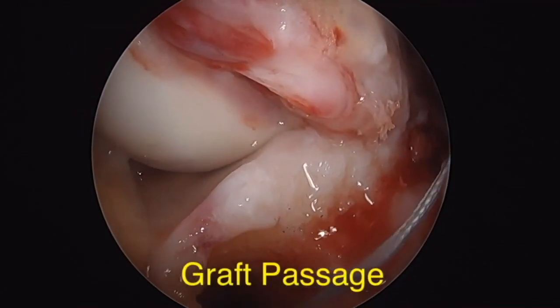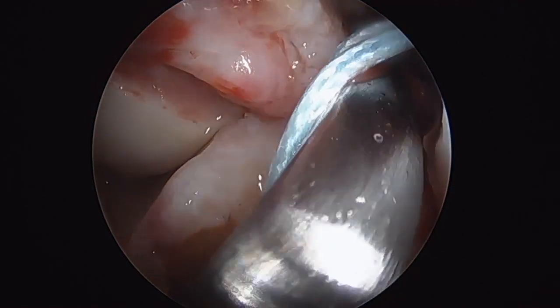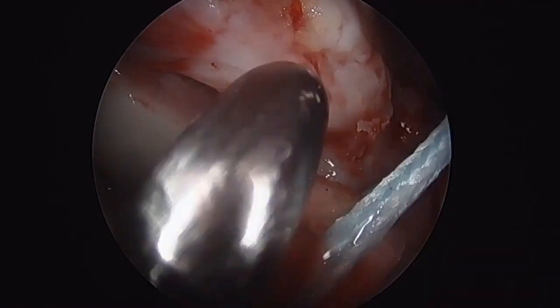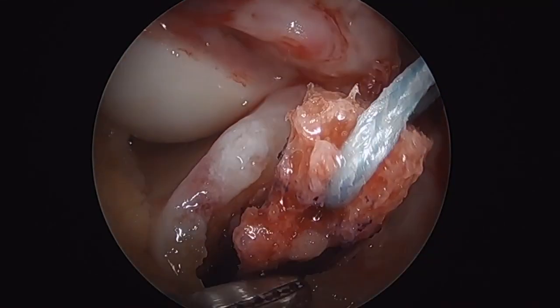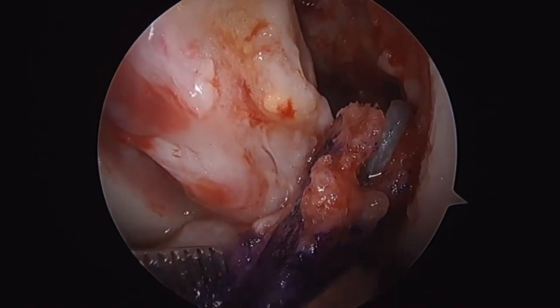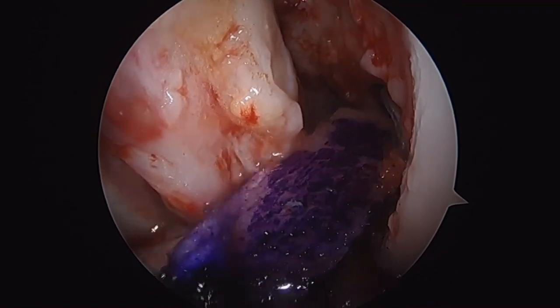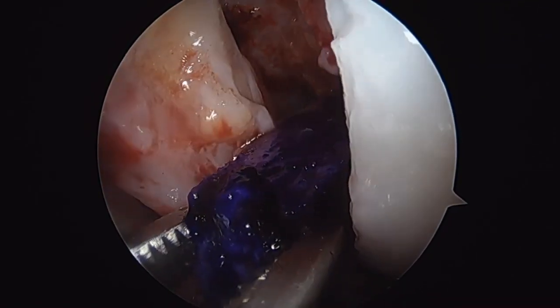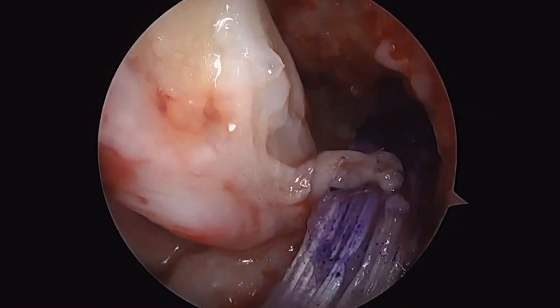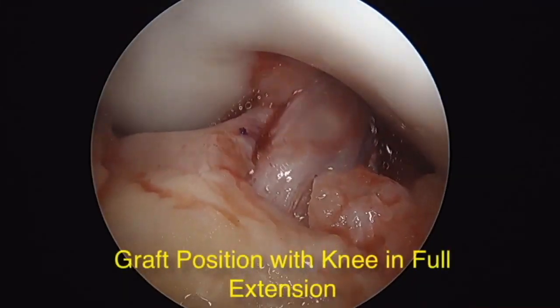Once preparations have been made, the sutures on the bone block should be drawn through the loop of the passing suture, which can then be advanced through the femoral tunnel through gentle tension on the passing sutures. During this step, a hemostat may be placed through the anteromedial portal to help ensure proper positioning and facilitate graft passage, with the goal of orienting the graft so the soft tissue is posterior and inferior relative to the bone block. It can be beneficial to shut off irrigation to the joint — this serves a dual purpose of providing improved visualization and preventing obstruction of the field of view due to bleeding, and also prevents the risk of excessive graft movement due to irrigation pressure.